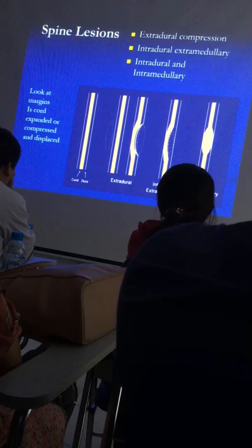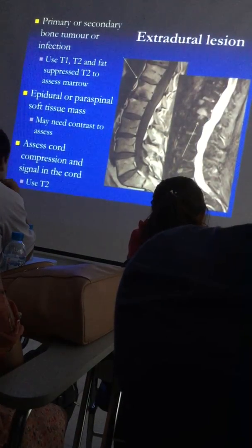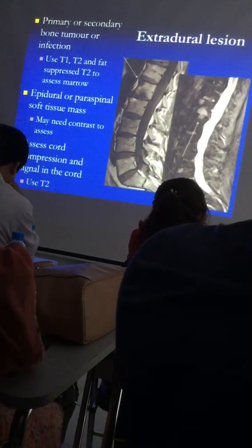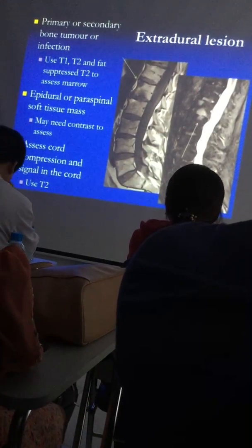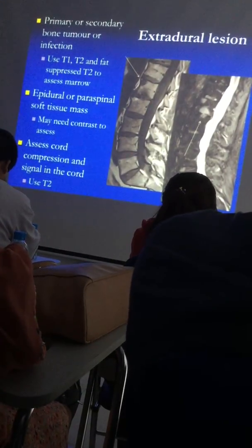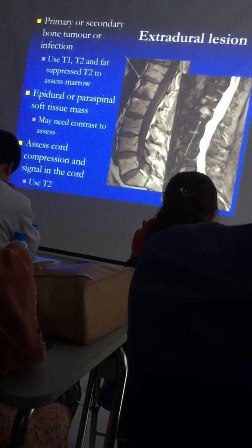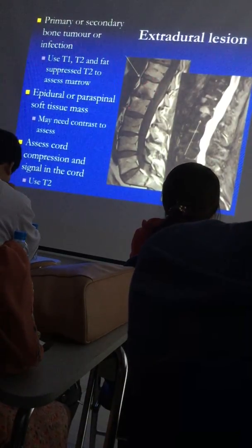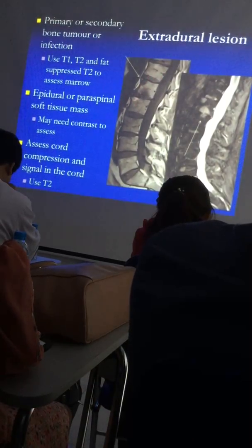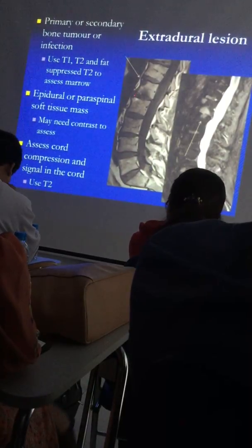We all live in a world of lists as radiologists, so look at the lists. So if we're looking at bone lesions to start with, for me to characterise them appropriately, what I usually use is a T1 and a fat suppressed T2 image. So dark on the T1 is bad, bright on the T1 is good. So that's a metastasis, and that's a bit of fatty end plate change adjacent to a degenerative disc.